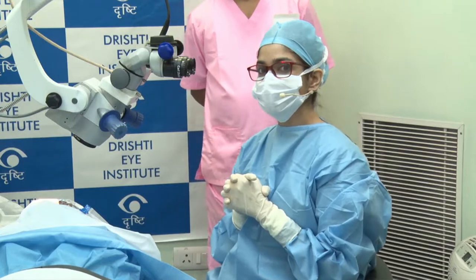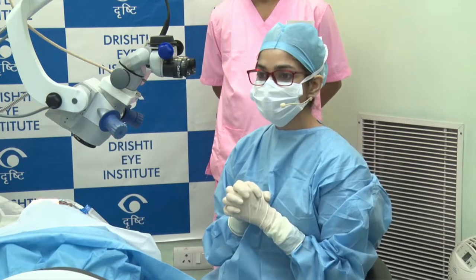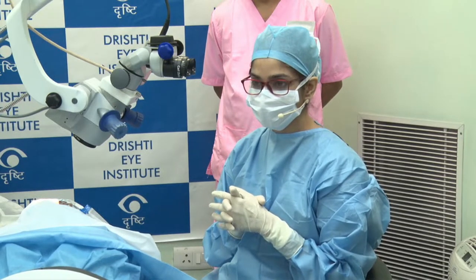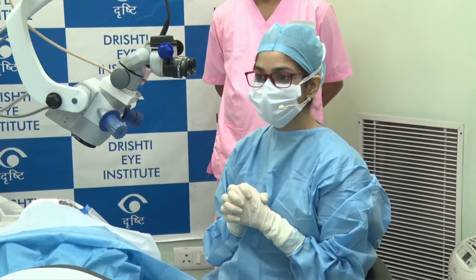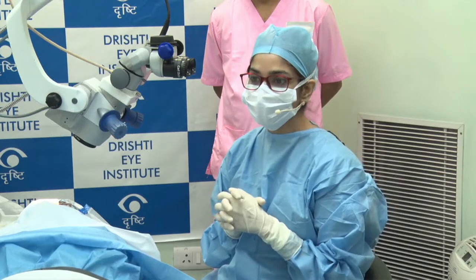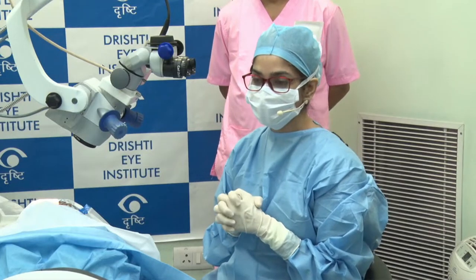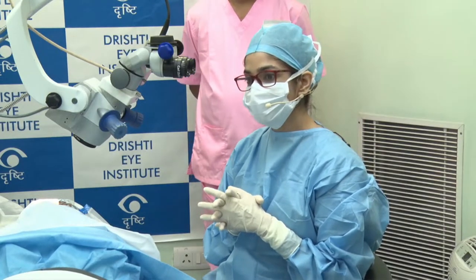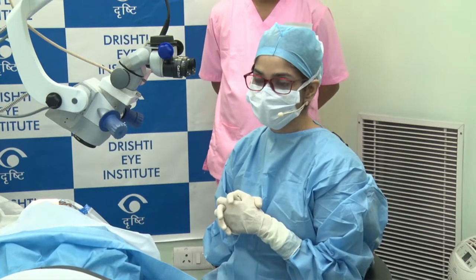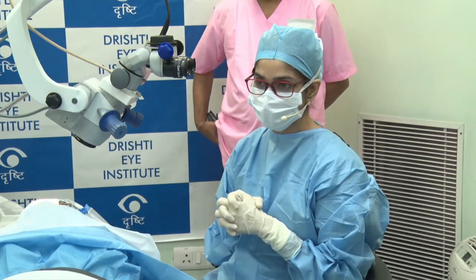Madam, what is the incidence of developing cataract after putting this stent if the patient was phakic? Sir, there has been no study done like that because usually patients who undergo a standalone eye stent are phakic with no cataract. They're young patients. And also one has to understand this is a very new device, so it's not like we have longer than 5-year follow-up. In the study done in the US, there was no cataract development for the standalone procedures at the end of 5 years. So that's the longest follow-up we have for this device.